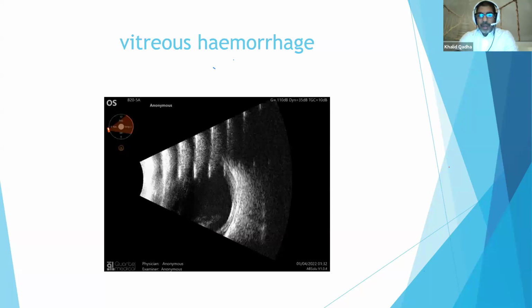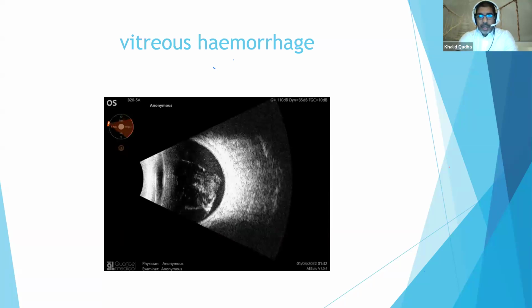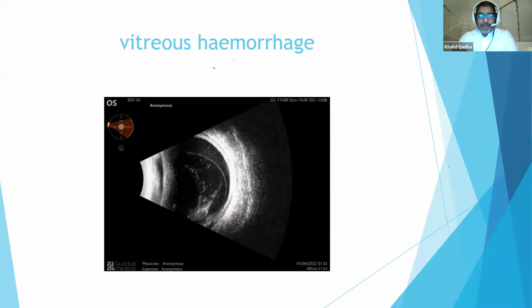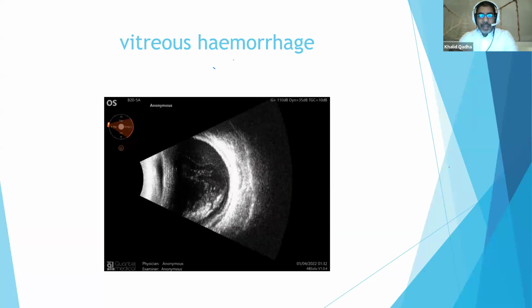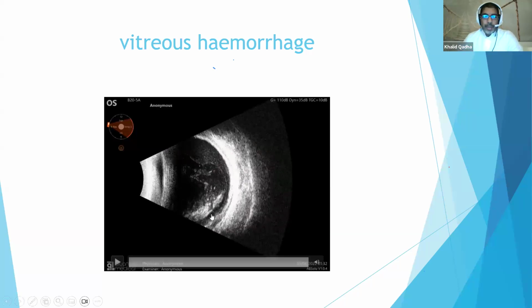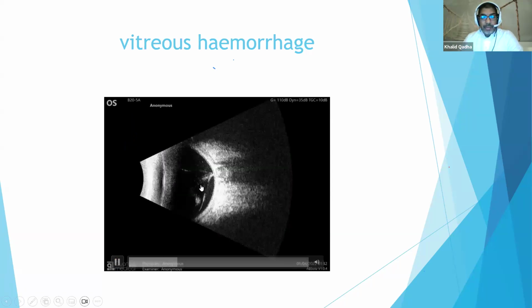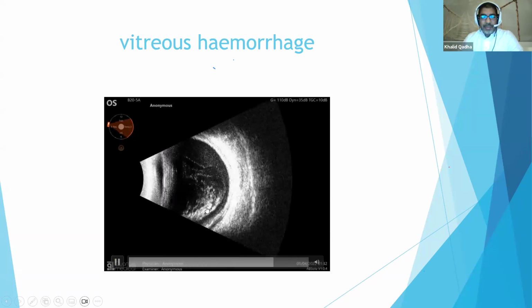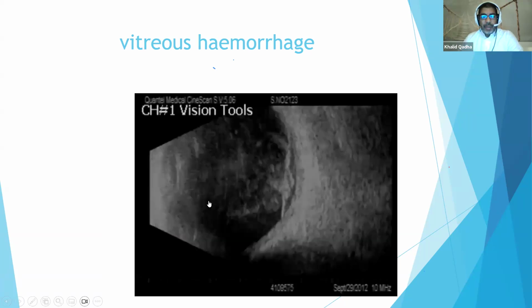This is a video about a vitreous hemorrhage. You can see here there is a hyperechoic area, which is the reflectivity in the vitreous, the white area here, and also you can see the PVD and subvitreal hemorrhage also. We'll repeat this video again. You can see with the movement, it's inserting to the optic nerve as they actually adhere to the optic nerve, and you can see that there is some movement from the blood.